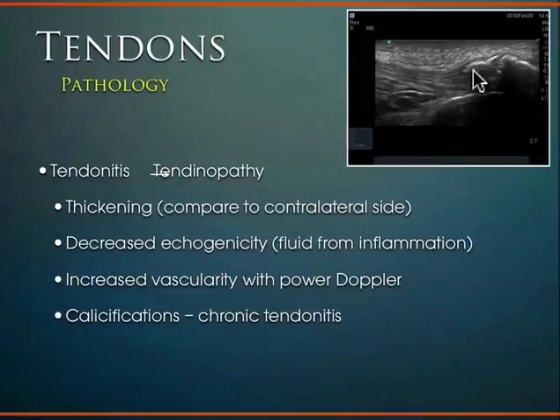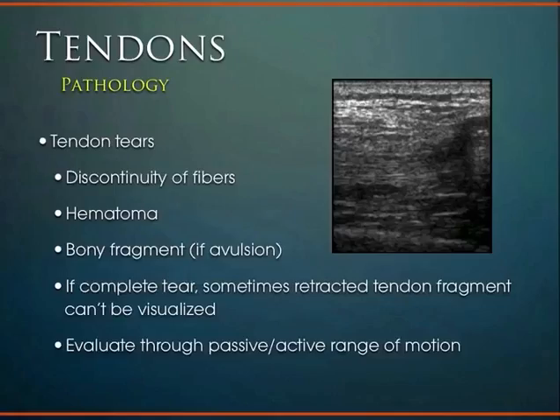And just like bone, the calcific changes that you can see on this image here tend to be very thick hyperechoic structures. So these are calcific changes within the tendon architecture through here. And just like bone, you're going to get a lot of deep shadowing below that very hyperechoic thick tissue because the sound waves don't penetrate through. So you see nice normal tendon tissue coming across, and you see this calcific change. So a nice example of some of the pathology that you can see.